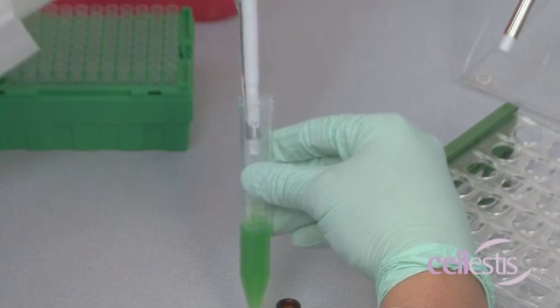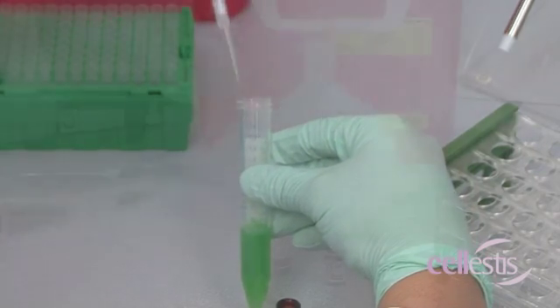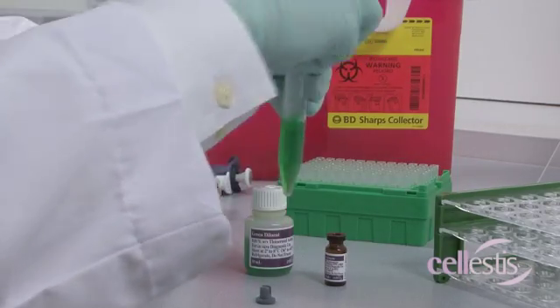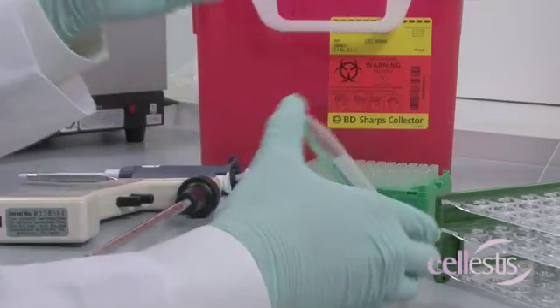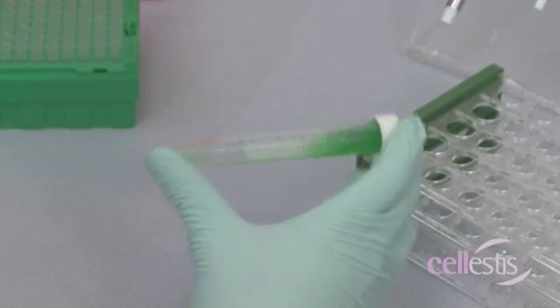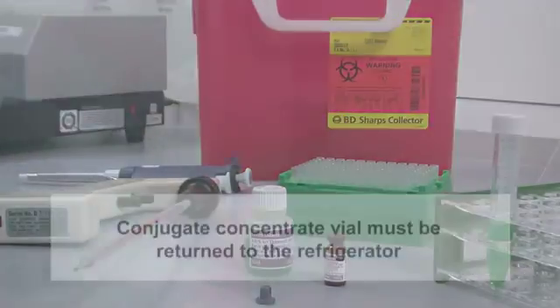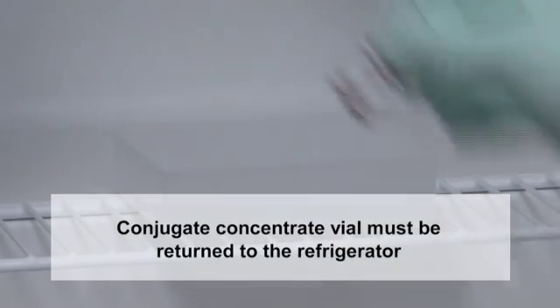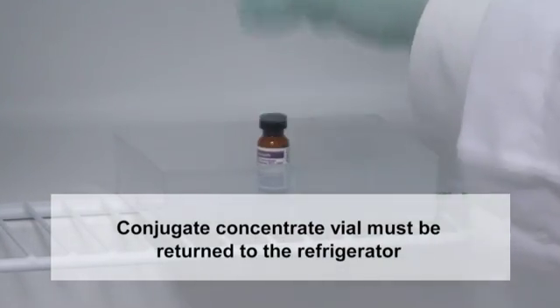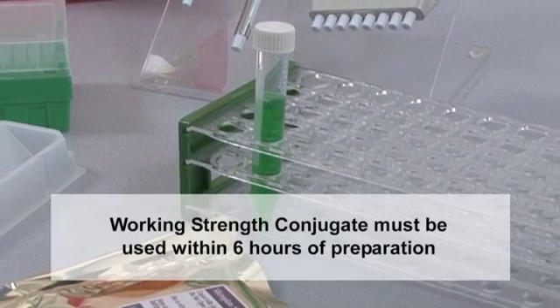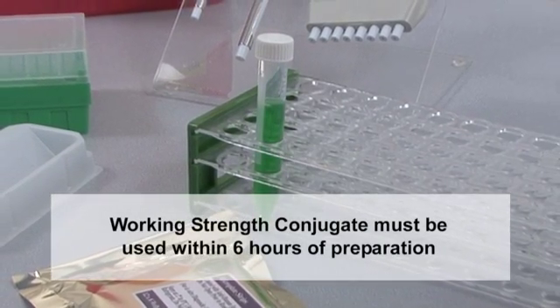Mix the correct volumes of conjugate concentrate and green diluent together thoroughly but gently to avoid frothing. The conjugate concentrate vial must be immediately returned to the refrigerator. Working strength conjugate must be used within six hours of its preparation.